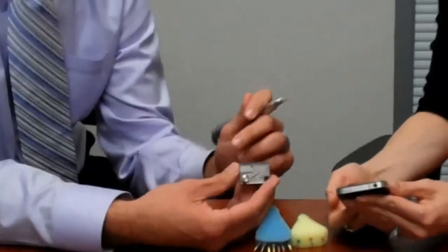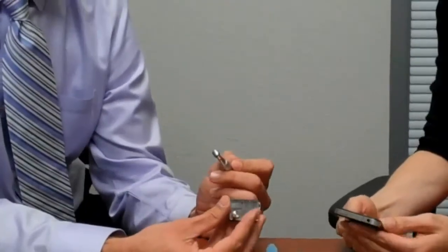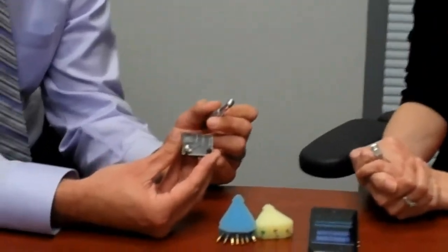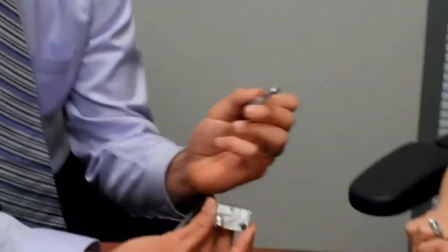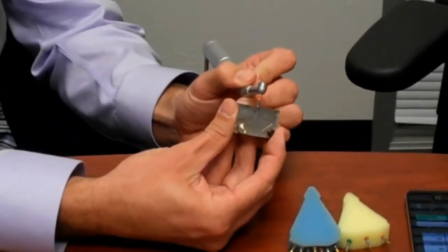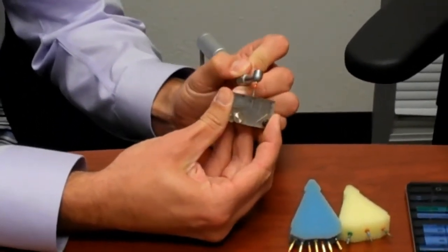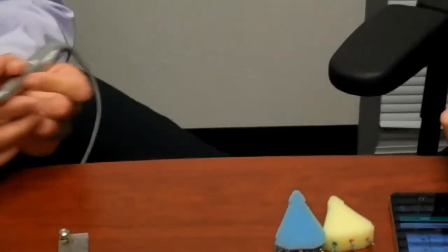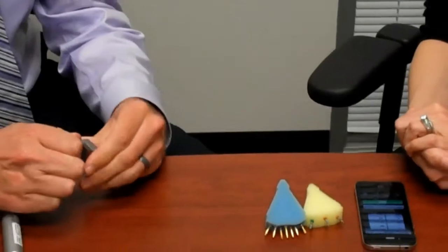We'll count out loud. I'm going to start taking this into the simulated curved canal, and I want you to count how many insertions it takes before the file breaks. One, two, three. Three — it's done. So now I'm going to do the same thing and empty this out.